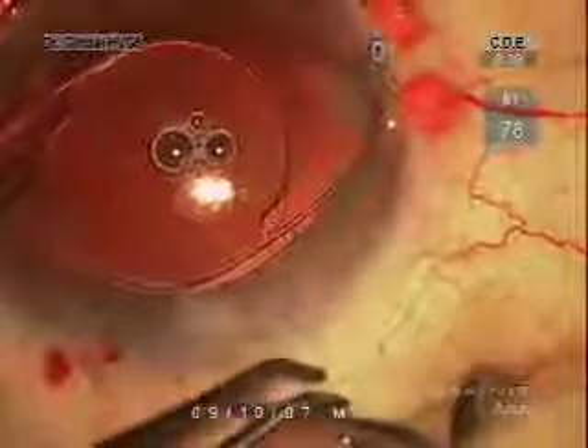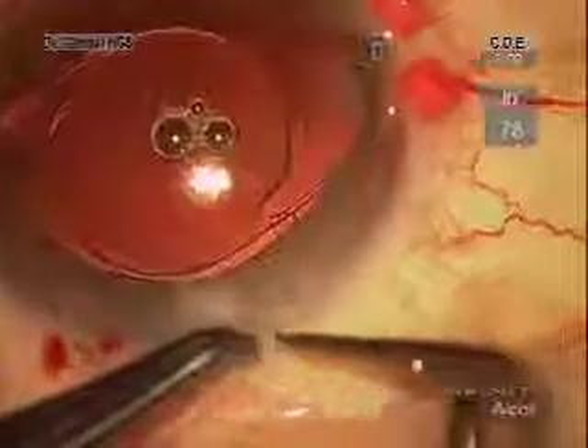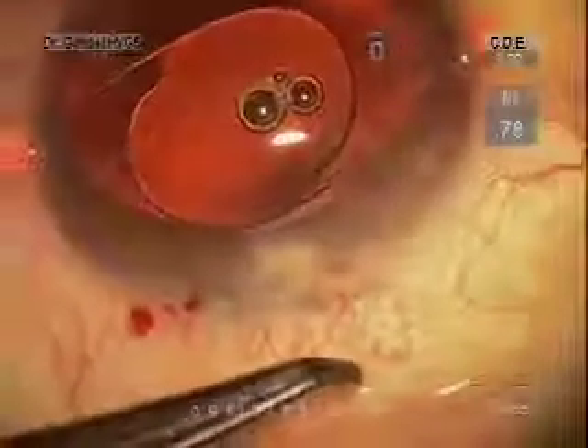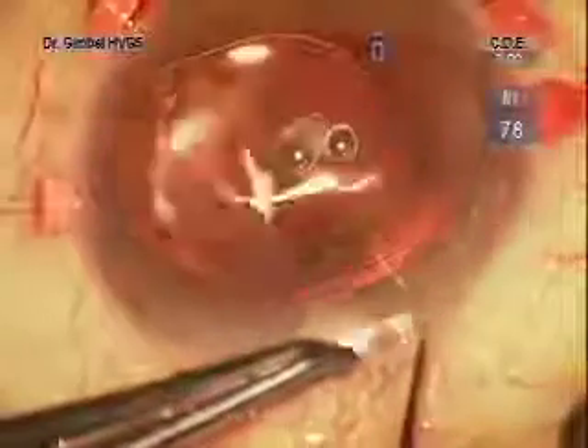This avoids having to place the knot down into the eye with forceps. Certainly micro forceps would make that possible even through a small incision, but this is an ingenious technique of wrapping the end around this loop of suture and then through the loop, and pulling it down with traction on each end of the suture, which brings the knot down onto the haptic. We're not going to complete this knot until we're sure that the lens is in good position.